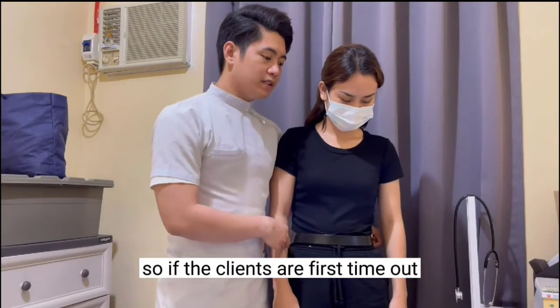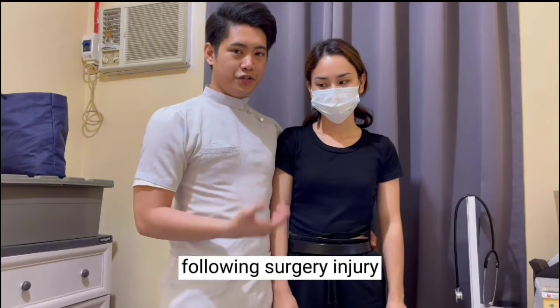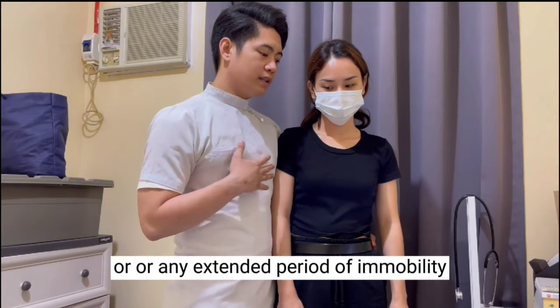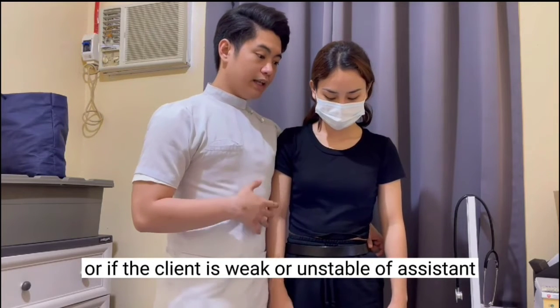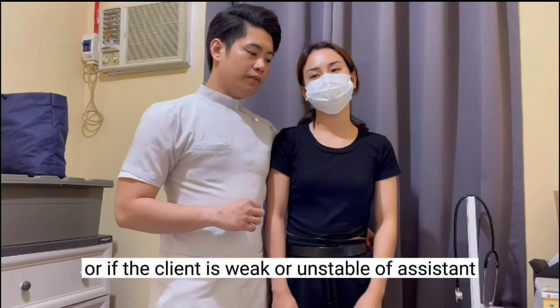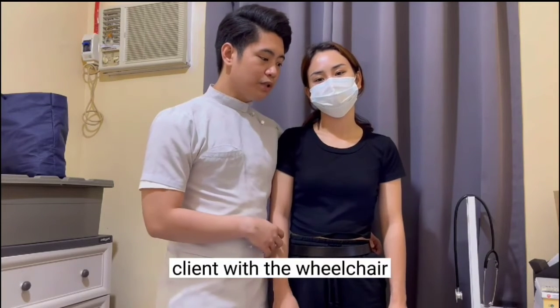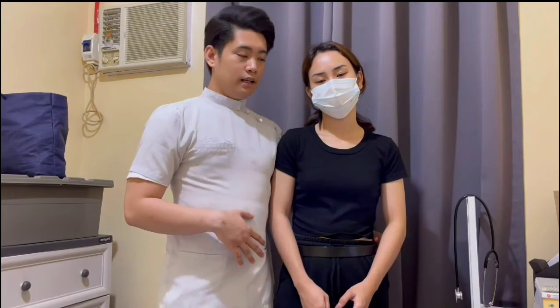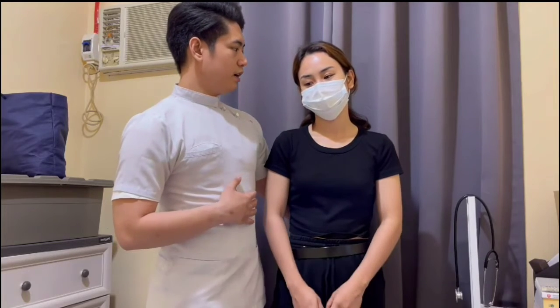If it is the client's first time out of bed following surgery, injury, or any extended period of immobility, or if the client is weak or unstable, have an assistant follow you with a wheelchair in the event it is needed quickly. So, ma'am, do you have any past surgery or injury?